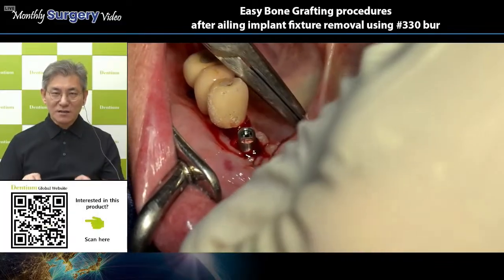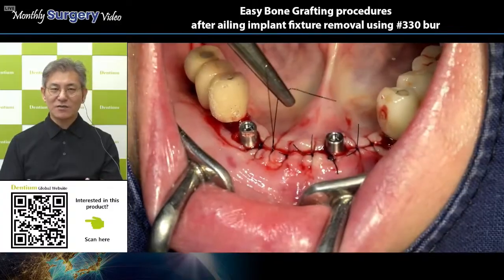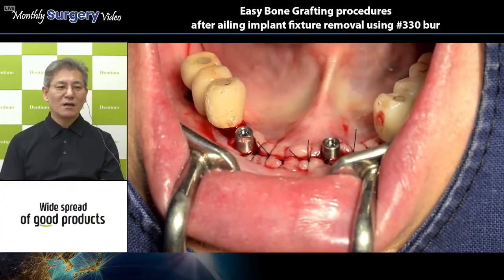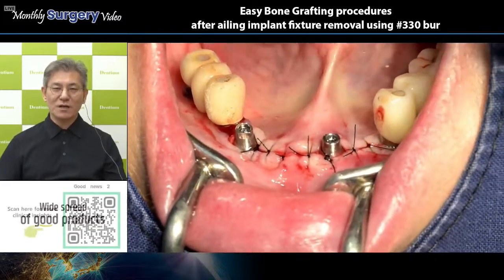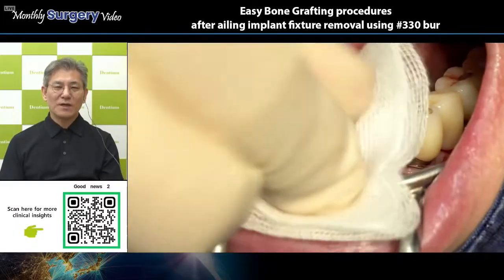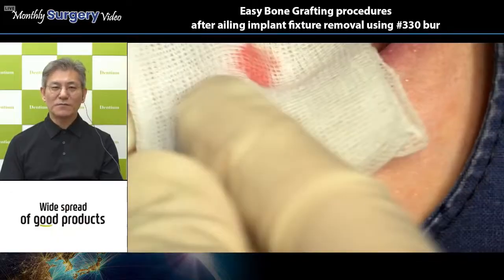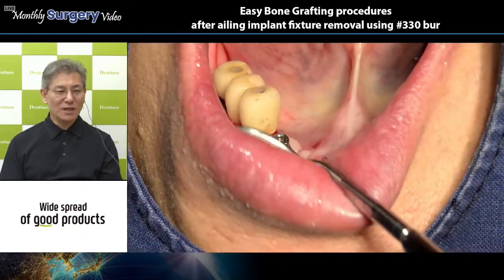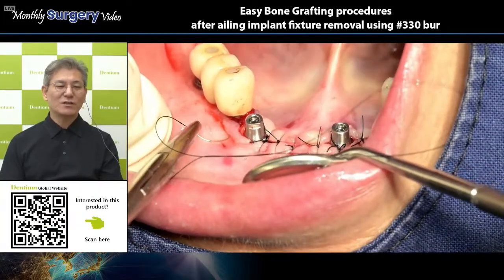For this purpose, sometimes screw engaging is necessary, and a big collagen membrane should cover all of this GBR area. That is a complex, complicated procedure that is not good for an elder patient. However, today's surgery is simply done and very fast for the patient.